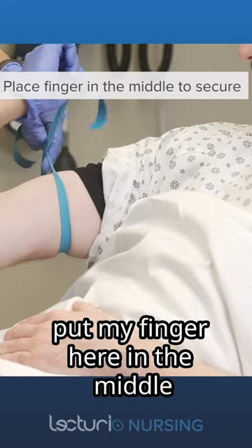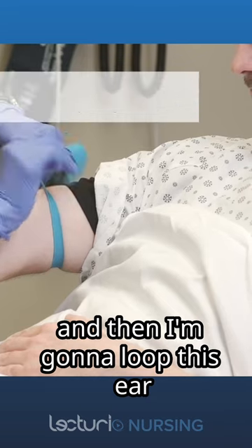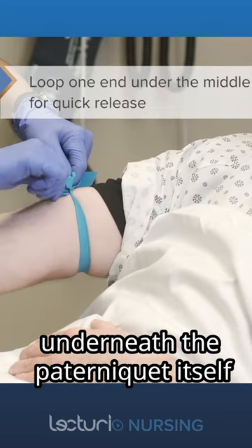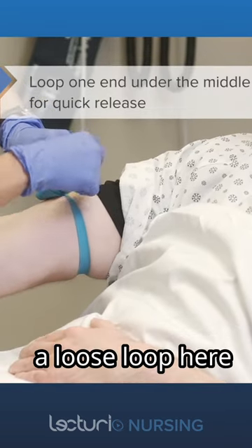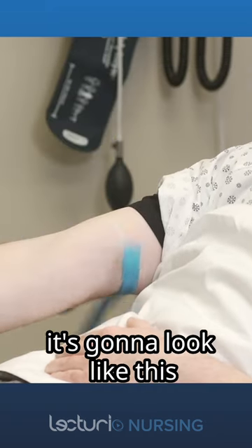I put my finger here in the middle like making an X, and then I'm going to loop this ear underneath the tourniquet itself. We're going to have a loose loop here and you're going to see that tail out. If I need to release it, it's going to look like this.